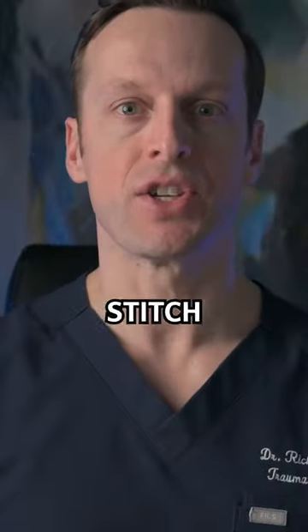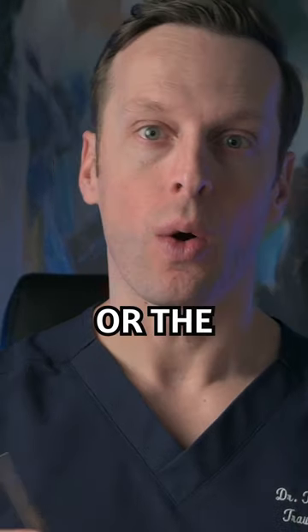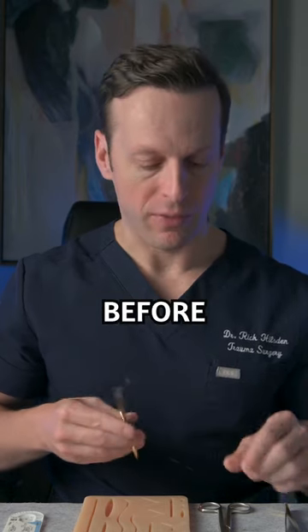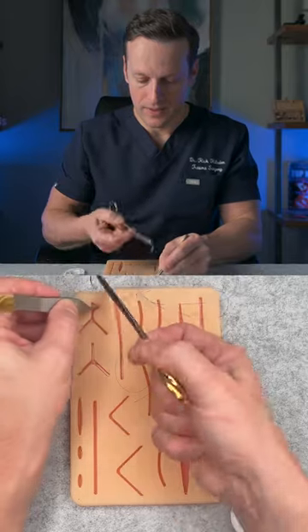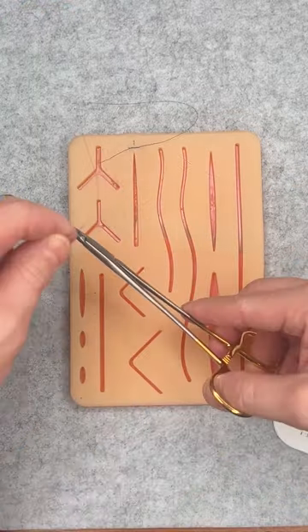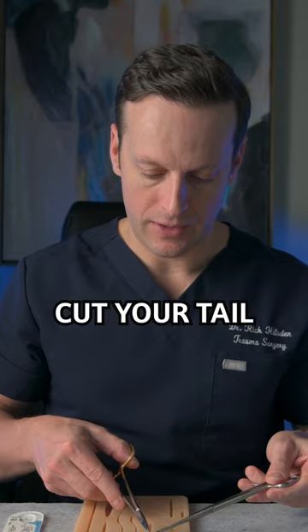We're learning the most underrated stitch in medicine — the simple continuous stitch, or the baseball stitch. It starts off just like a simple interrupted stitch that we've learned before. You take your bite and do your initial square knot, then cut your tail to make it easier.